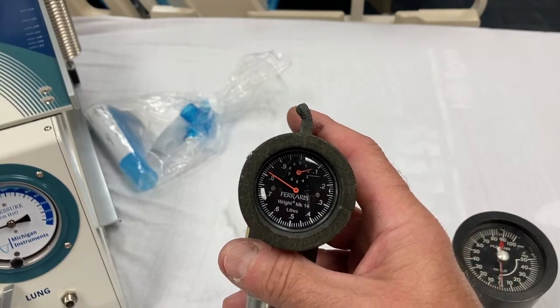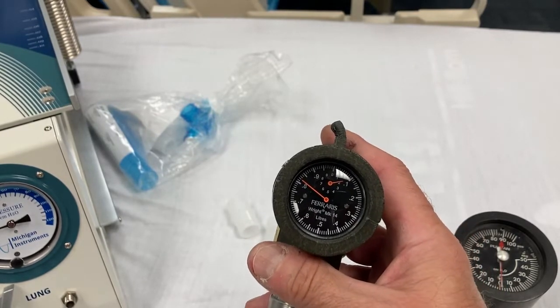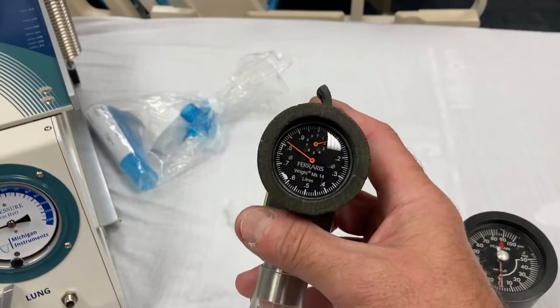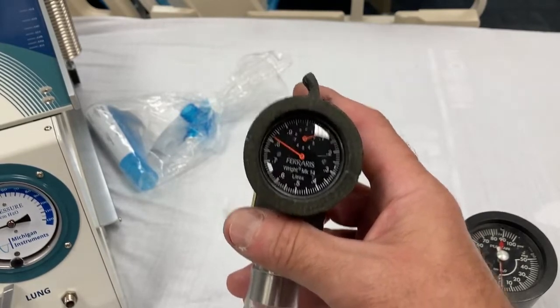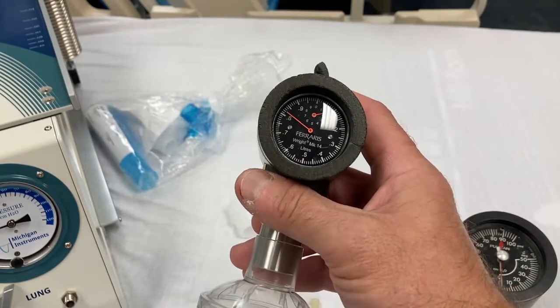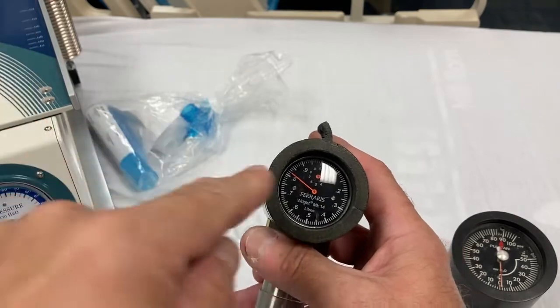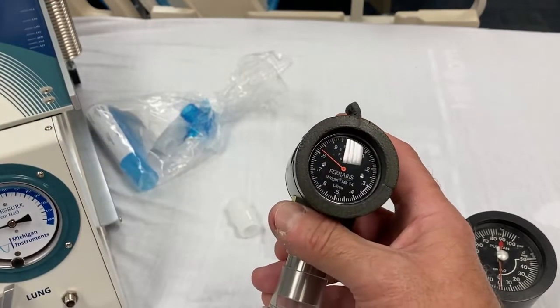When I tell you, breathe in as deeply as you possibly can and blow that one breath out until I tell you to stop. Now, if you tell them, take in a deep breath and keep blowing until I tell you to stop, a lot of times you'll get them doing these huffs, like that. So I like to specify, breathe in as deep as you possibly can and blow that one breath out until I tell you to stop. And I tell them to stop when I see that needle stop moving.